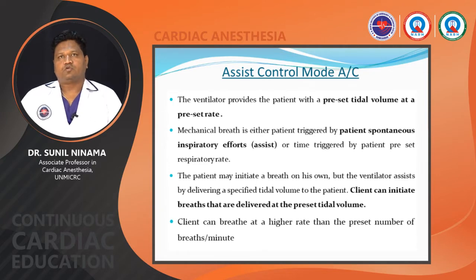Now there is assist control mode. As the name suggests, the ventilatory mode assists the patient. You set the preset tidal volume at a preset respiratory rate. A mechanical breath is either patient triggered by the patient's spontaneous inspiratory effort when the patient tries to breathe, and in this mode, the ventilator assists that breath and gives the preset tidal volume. So it is time triggered also.